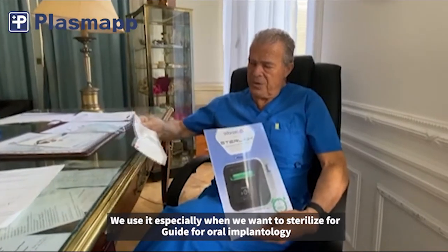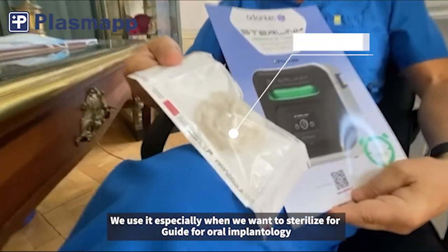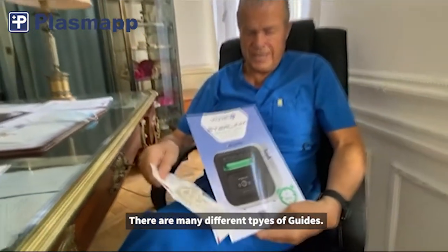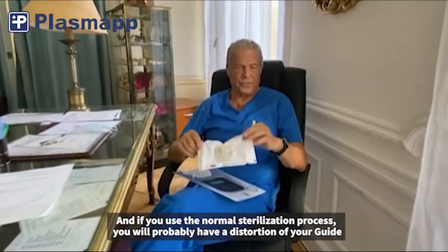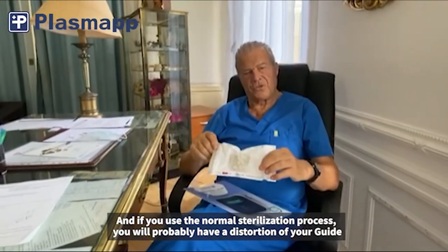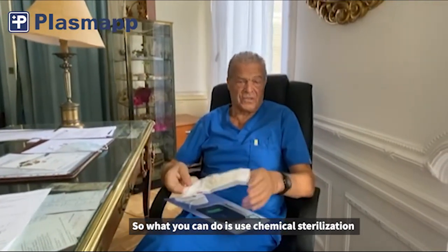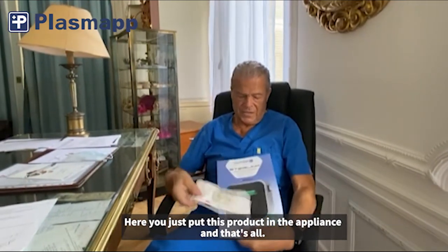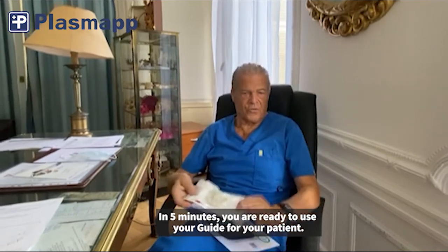We use it especially when we want to sterilize guides for oral implantology. There are many different types of guides, but the problem is they're made of plastic, and if you use a normal sterilization process you'll probably get distortion of your guide. So what you can do is use chemical sterilization — you just put the guide in the appliance, and in five minutes you're ready to use it with your patient.